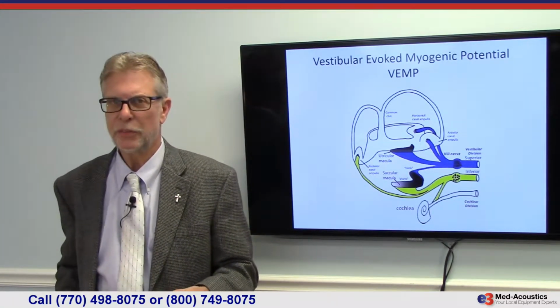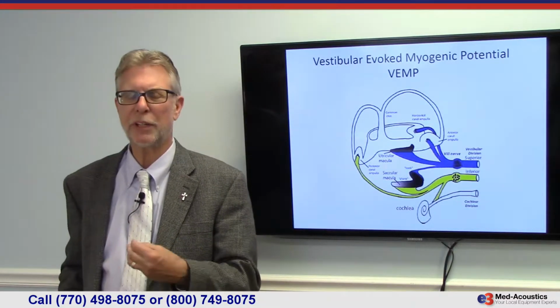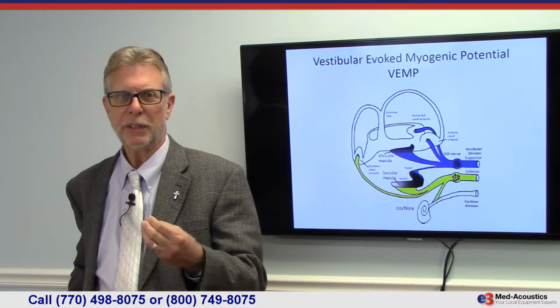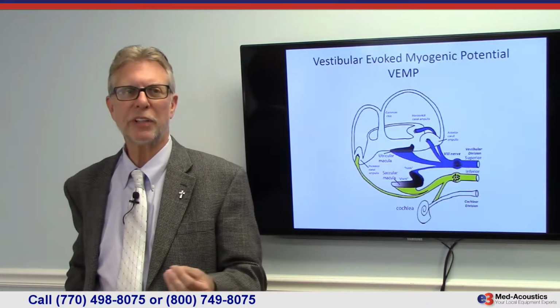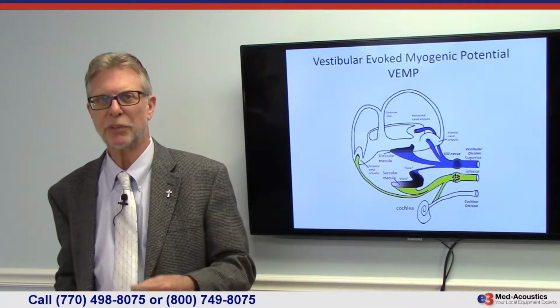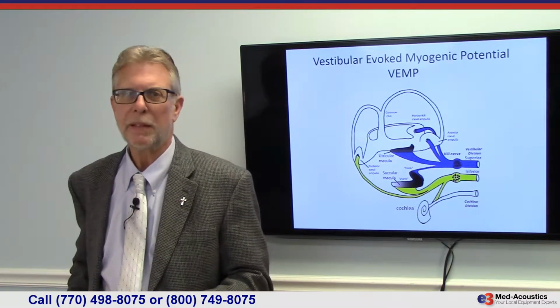And if you were to even add VHIT, video head impulse test, to that, then you would have a very, very, very comprehensive test set, because you would be able to test all 6 semicircular canals as well as all of the other anatomy involved in the vestibular system. Your sensitivity would go sky high.